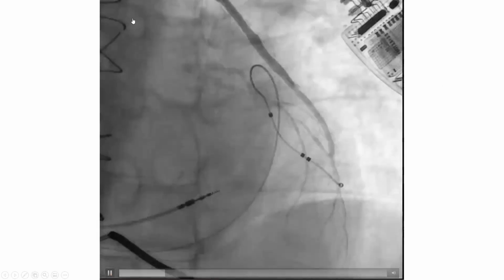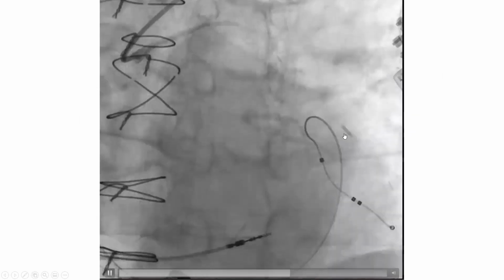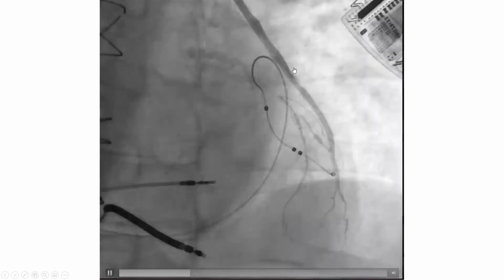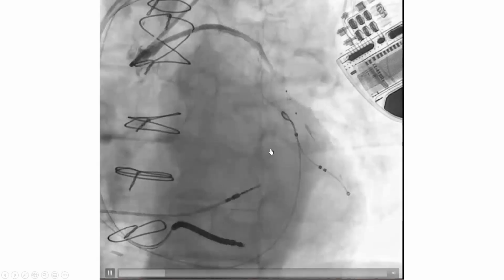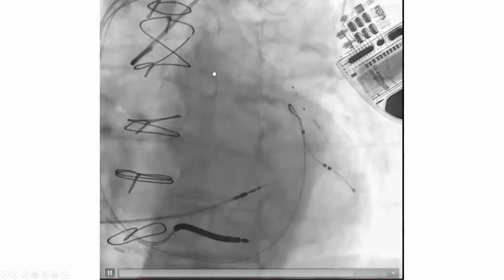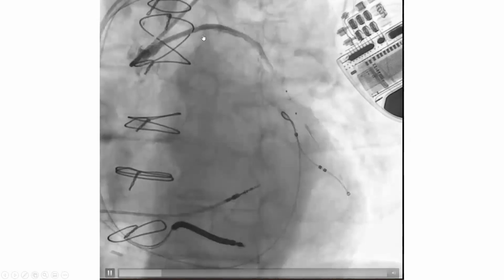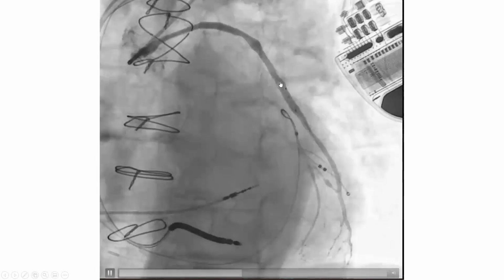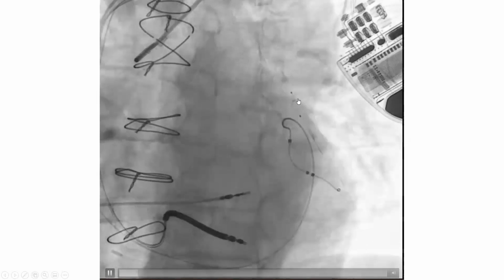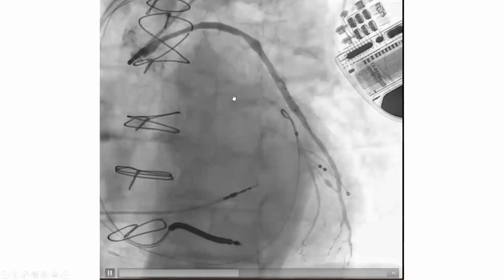This is an illustration of a case of a left graft to OM PCI that I did from a left radial access. I used a Spider catheter here. You can see the Spider here. And the interesting thing here, we stented, and after we stented, we're taking the picture, and you can see that piece of atheroma. Look at that. It's a piece of atheroma moving and getting stuck in the filter. That shows you how valuable the filter was in that case.